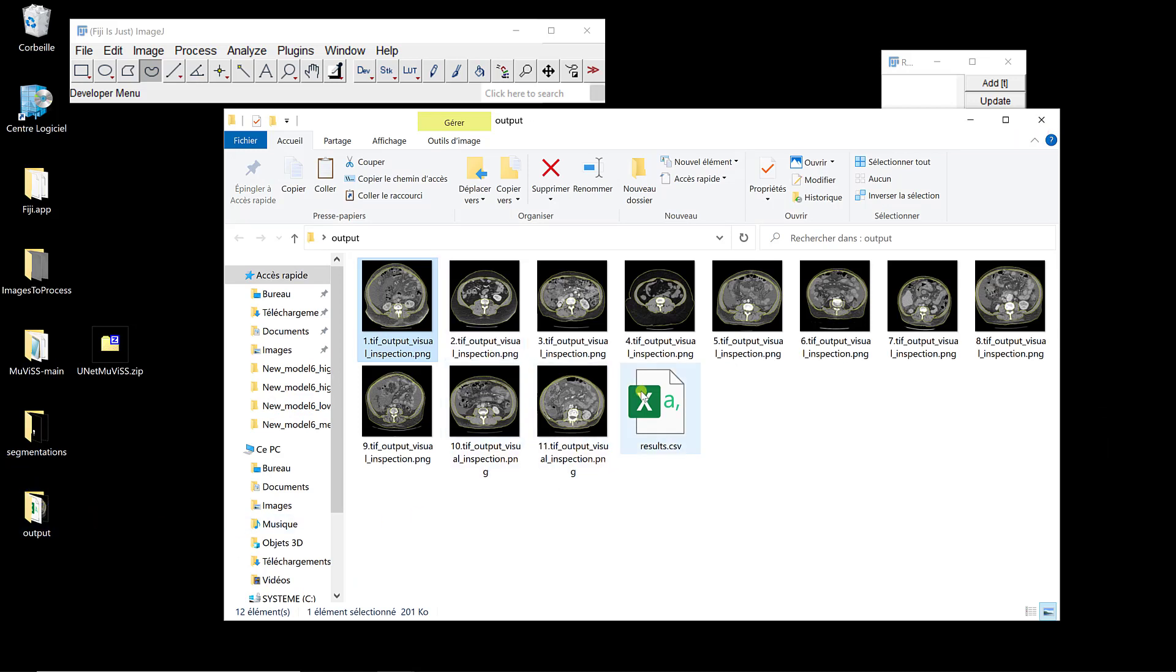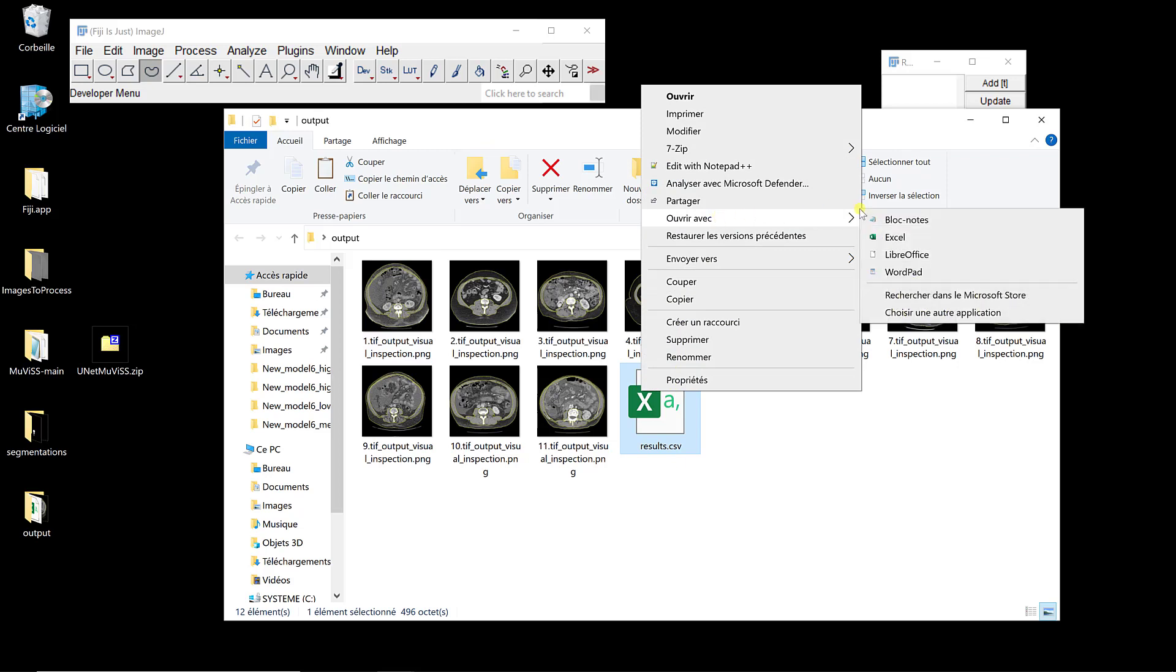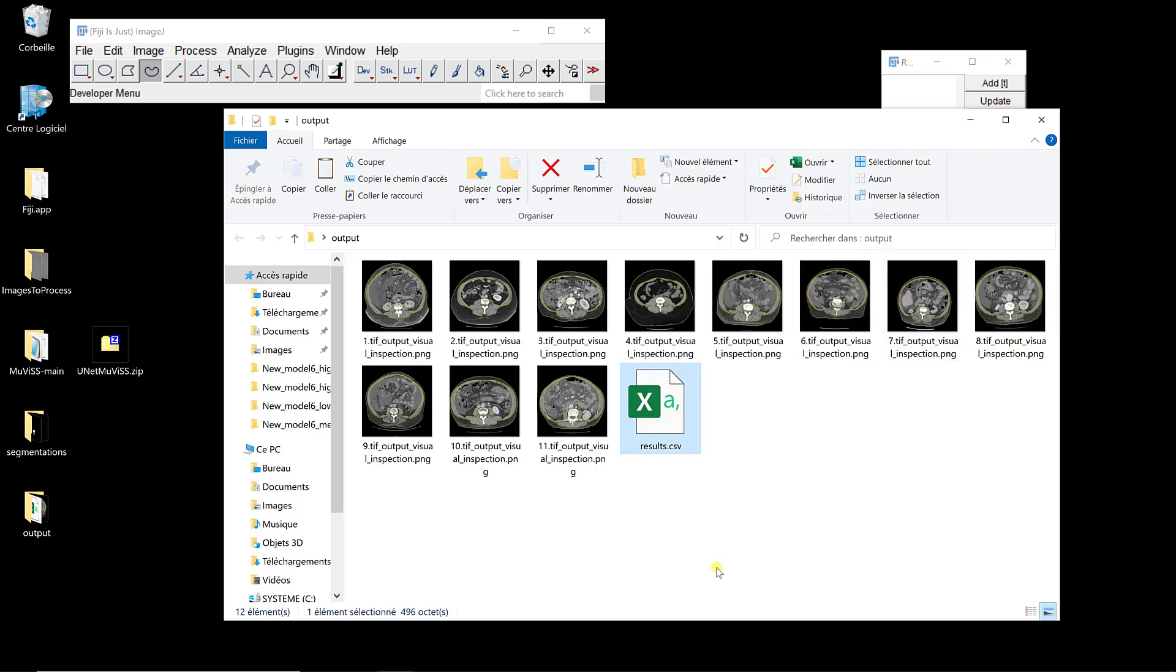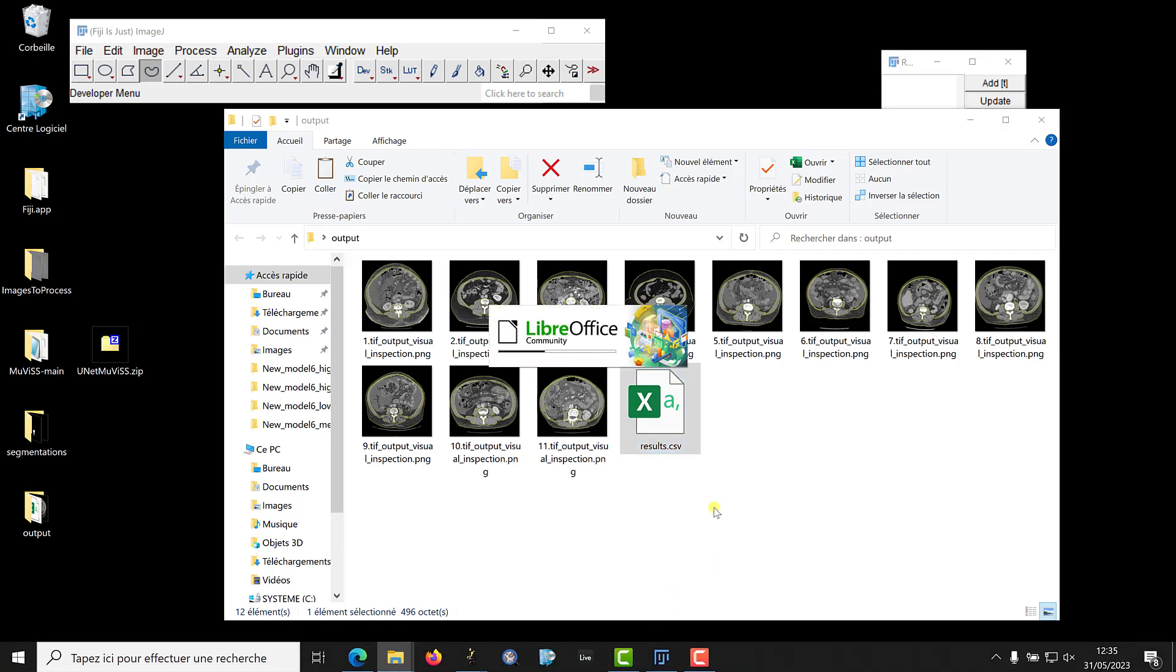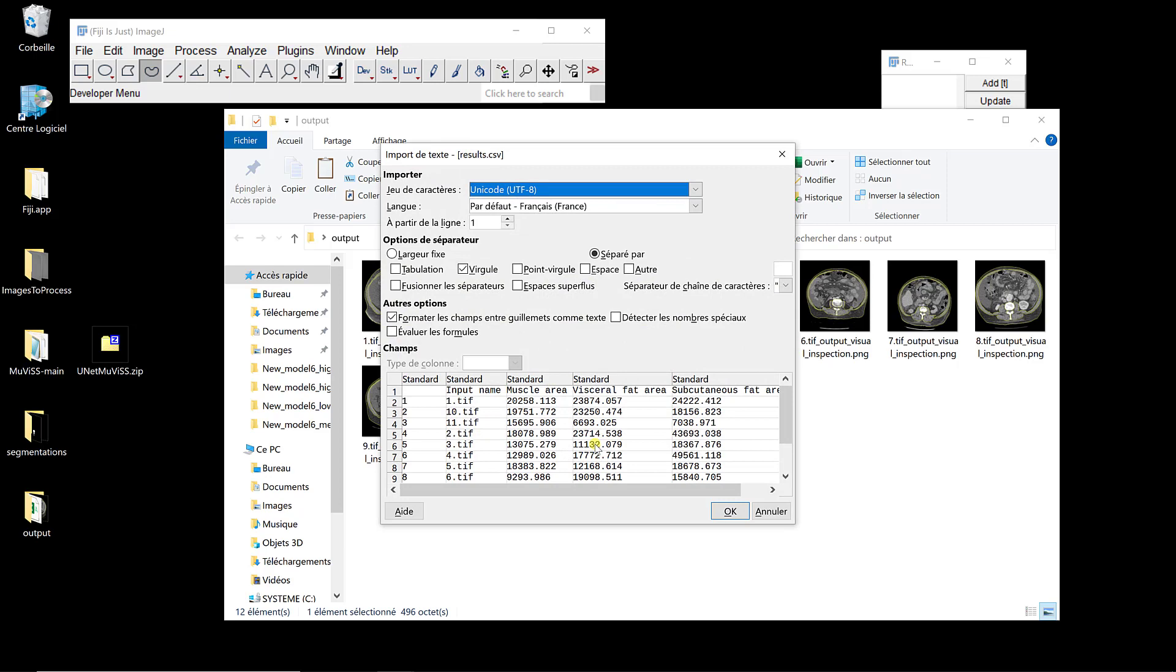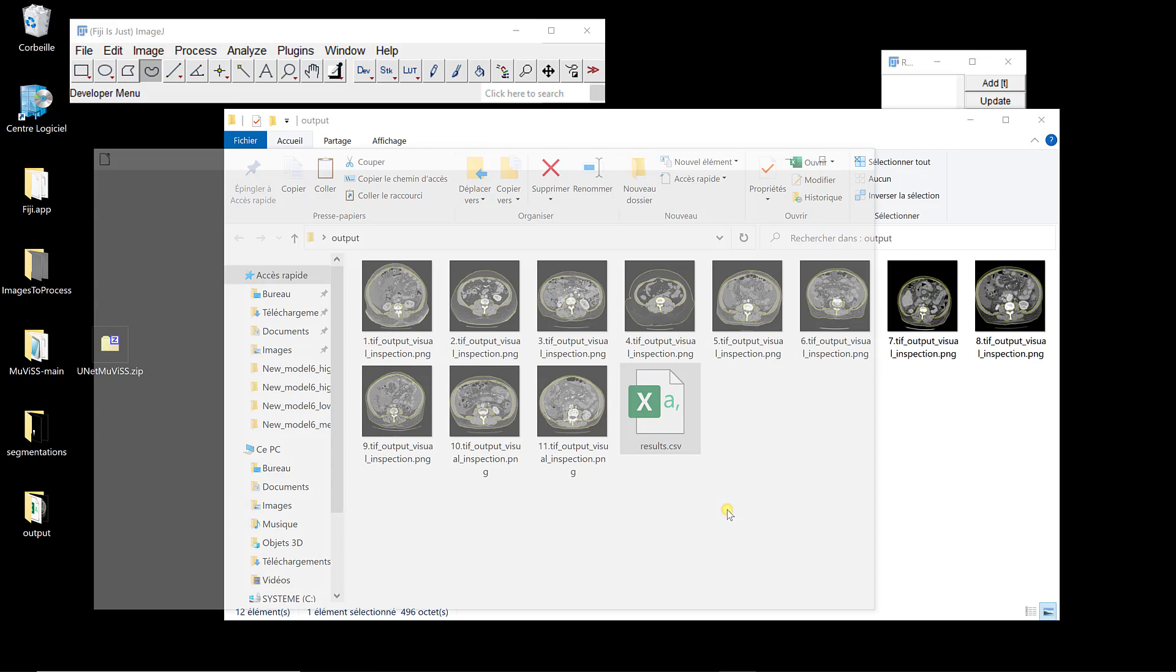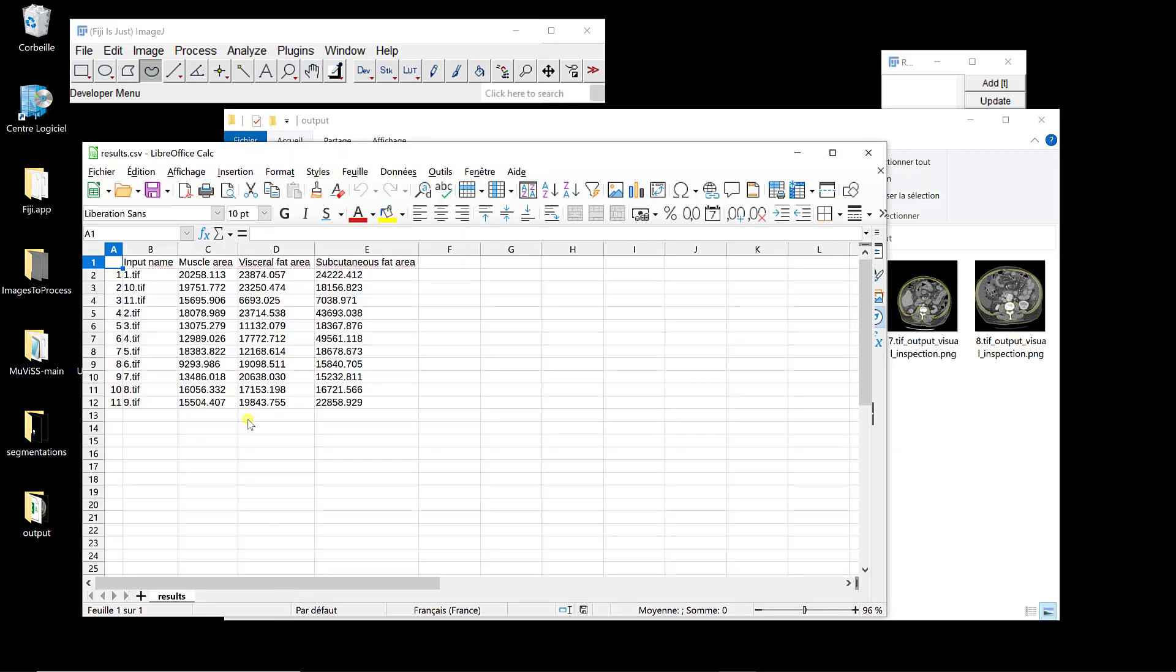And at the end, you also have a folder. So I'm going to open it this time with LibreOffice. And so you're going to have actually what you want to extract for your image. So input name, muscle area, visceral fat and subcutaneous fat area for each image.